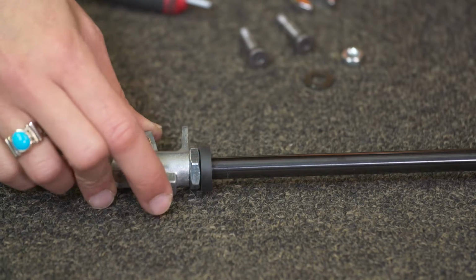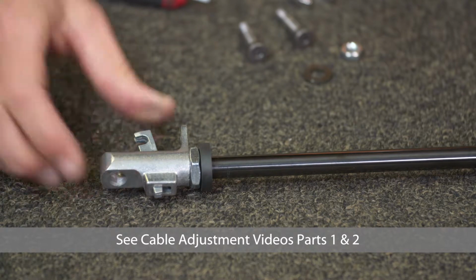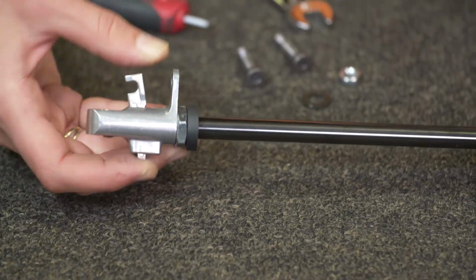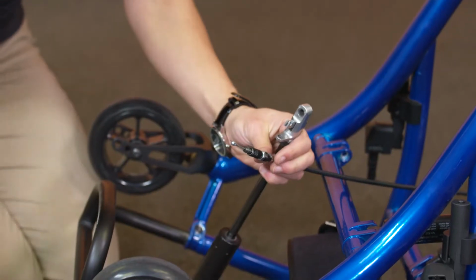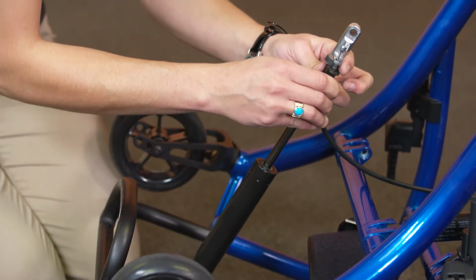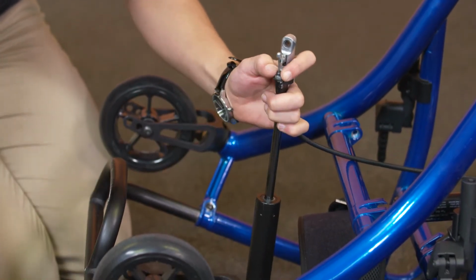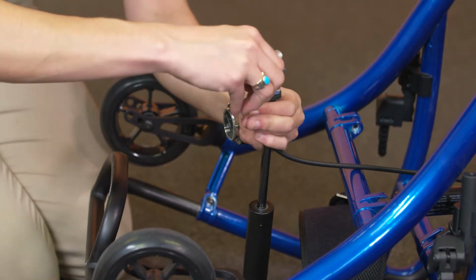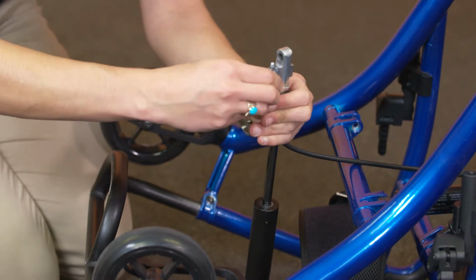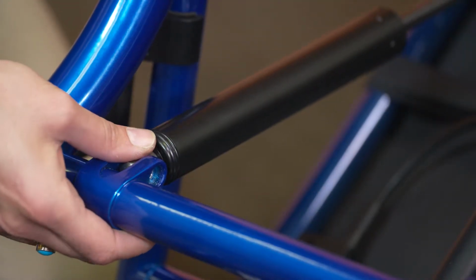Obtain a new gas strut assembly and ensure that the end fitting and release lever on the strut activator end are properly positioned. Next, reattach the cable to strut activator end fitting. And realign the mounting holes of the new gas strut assembly onto the chair.